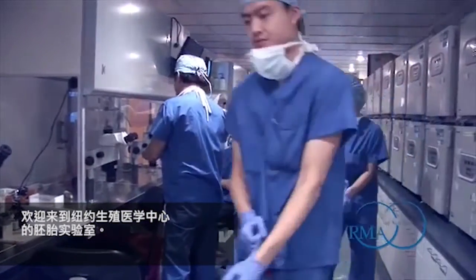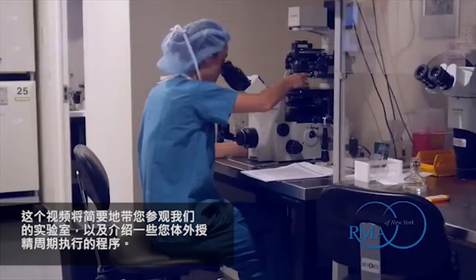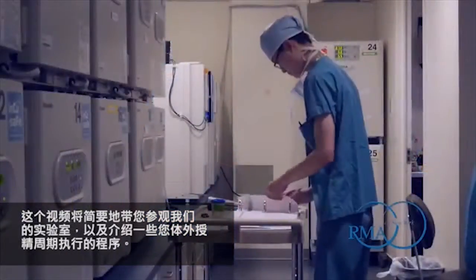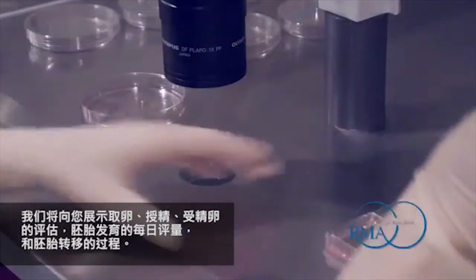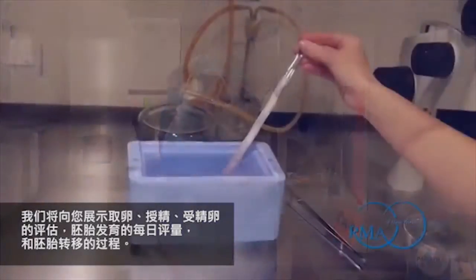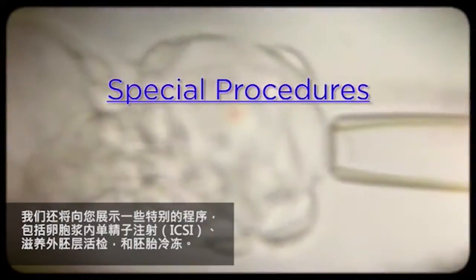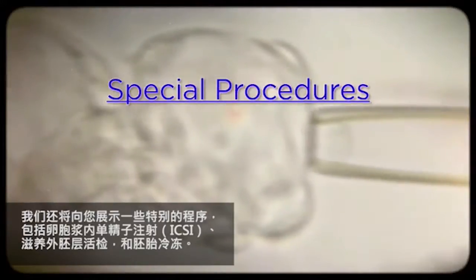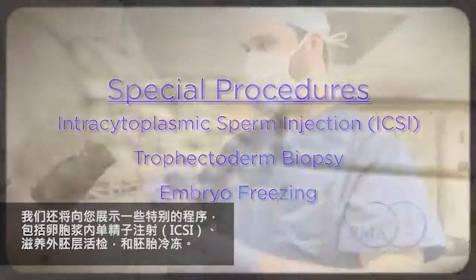Welcome to the Embryology Laboratory at Reproductive Medicine Associates of New York. This video will give you a brief tour of our laboratory and an introduction to some of the procedures performed for your IVF cycle. We'll show you an egg retrieval and insemination, an evaluation of egg fertilization, daily assessments of embryo development, and the embryo transfer procedure. We'll also show you some special procedures including intracytoplasmic sperm injection, trophectoderm biopsy, and embryo freezing.